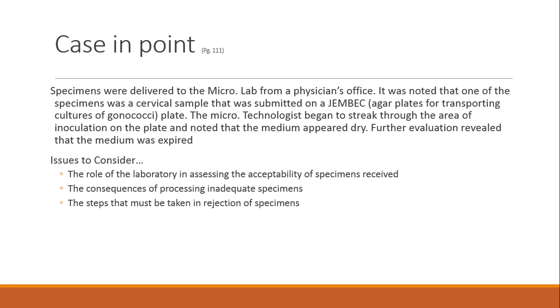And so you'll get media all the time from them that is expired, in which case, what do you think you should do? Go ahead and process the culture? You've got to notify somebody, right? Definitely call the physician's office and tell them that there's a problem with the sample and it needs to be recollected. Now, the physician may be adamant about processing the sample anyways, and in that case, you would definitely put a note in there saying that the results are compromised because the reagent or the medium was expired.